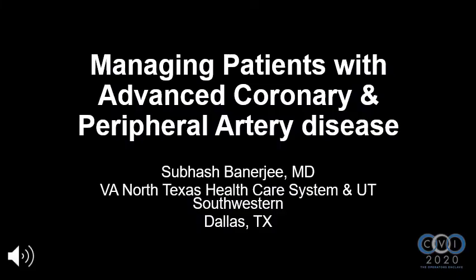Now, this case coming from our laboratories in the VA North Texas healthcare system and UT Southwestern in Dallas, Texas, exemplifies an everyday challenge that we face in the cath labs during managing patients with advanced coronary artery disease and peripheral artery disease.